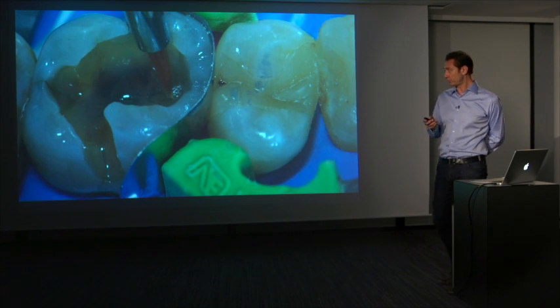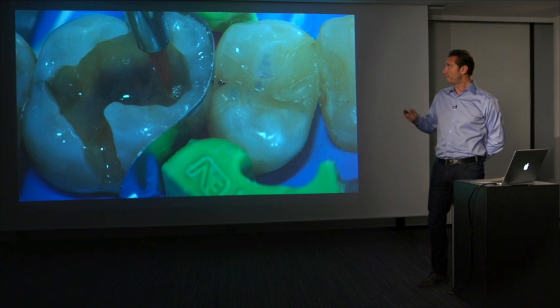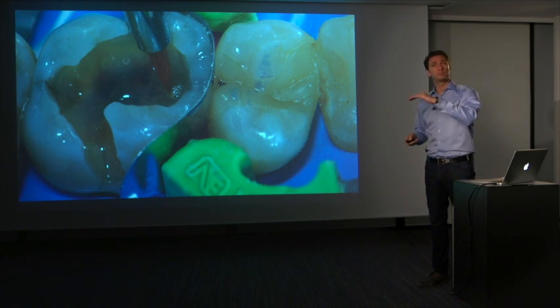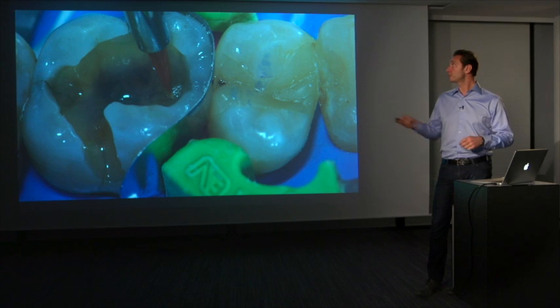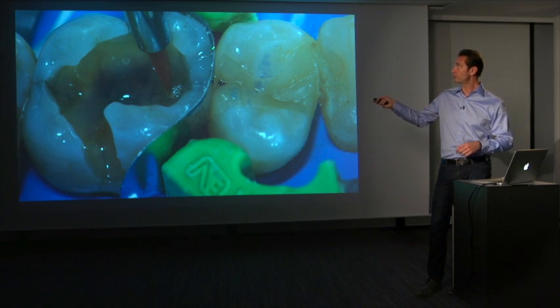What I like to use in these cases is a fine brush that helps me sculpt the proximal areas and create a very rounded marginal ridge. In relation to a spatula or a composite instrument, this allows me to create something rounded, a smooth transition between tooth substance and composite, especially along the matrix.